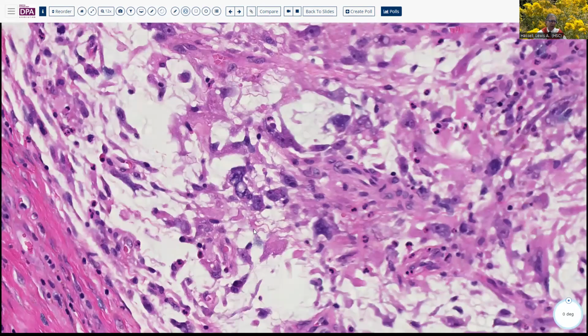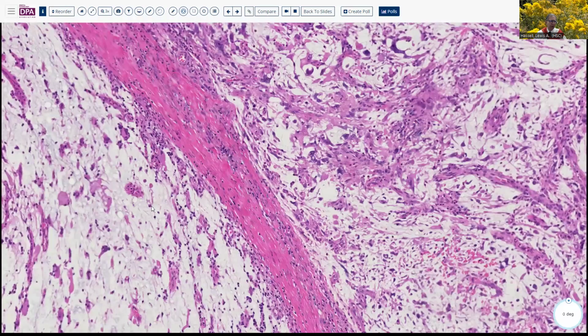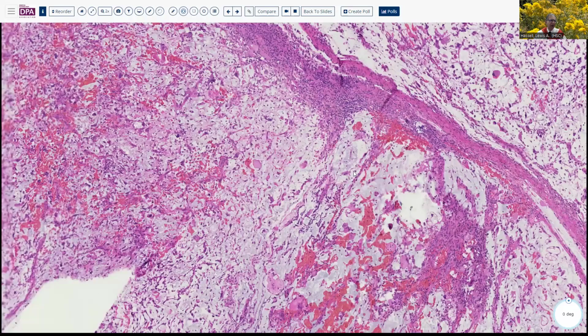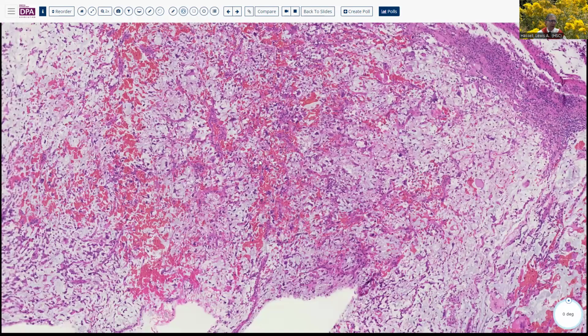As we think about this lesion of this degree of atypia, this is something that previously would have perhaps been termed inflammatory MFH or something in that categorization. This is what's now called myxoinflammatory fibroblastic tumor, and does tend to also have this extravasated red cell background as well.